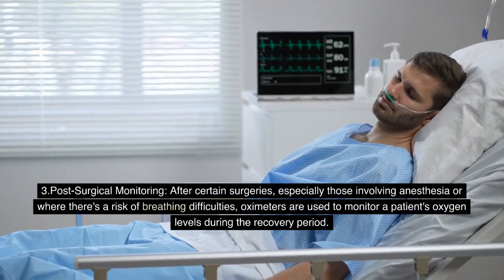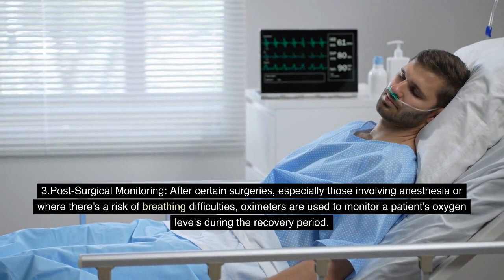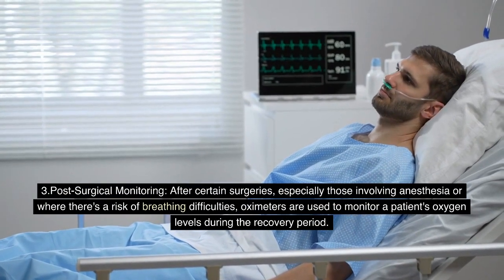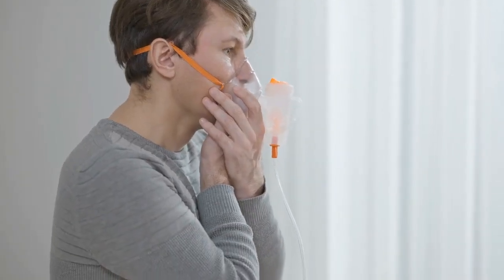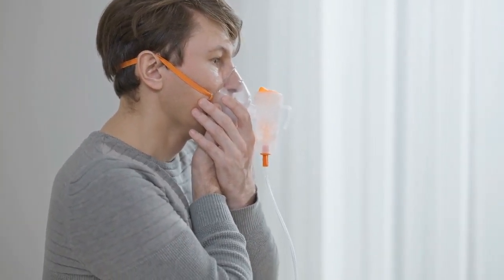3. Post-surgical monitoring. After certain surgeries, especially those involving anesthesia or where there's a risk of breathing difficulties, oximeters are used to monitor a patient's oxygen levels during the recovery period. This ensures that the patient is getting sufficient oxygen as they regain consciousness and resume normal breathing.